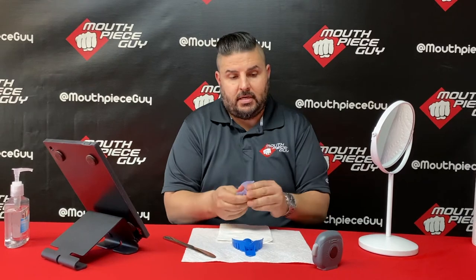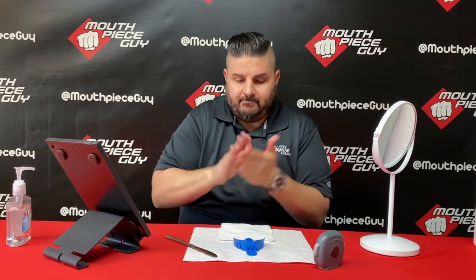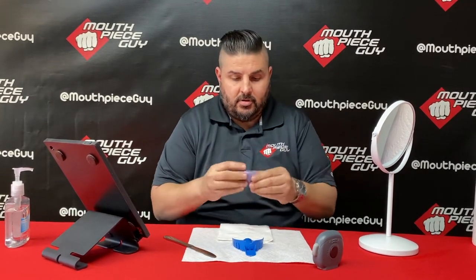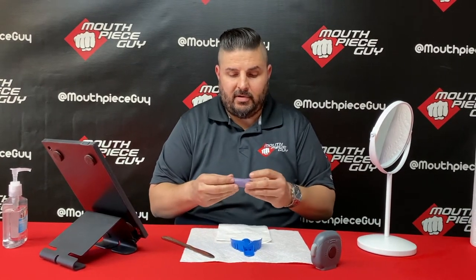I'm at 41 seconds right now — 45 seconds, there we go. Now we're going to make our little cigar shape, about four to five inches.